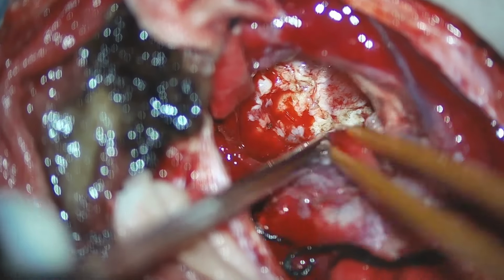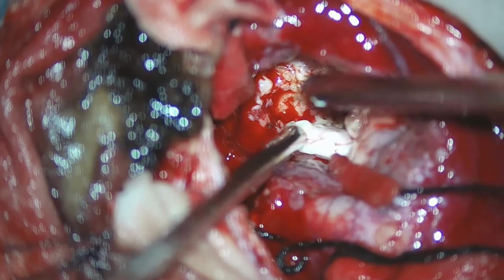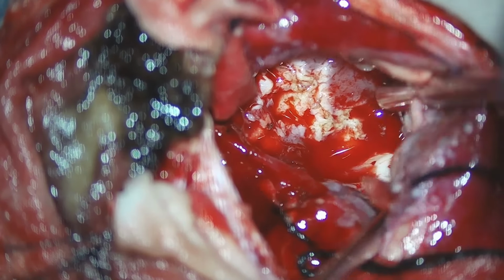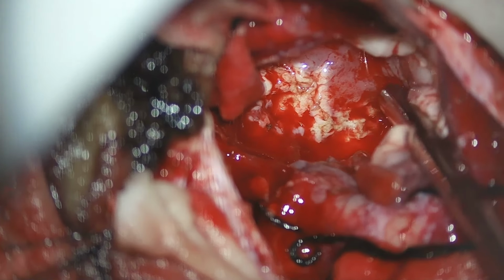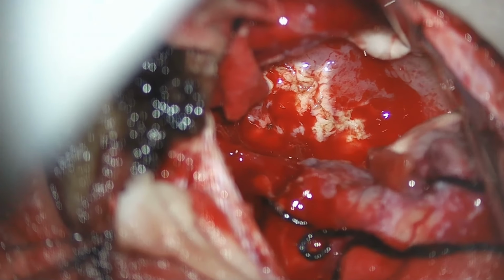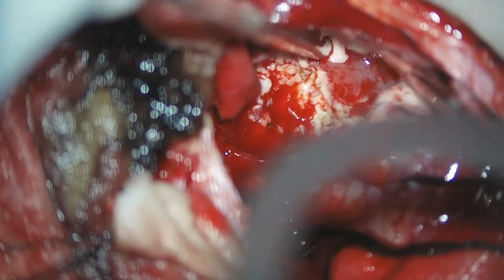A major chunk of the tumor has been removed, and we try to remove all the margins surrounding the tumor, and some part of the tumor which is difficult to be removed is coagulated.